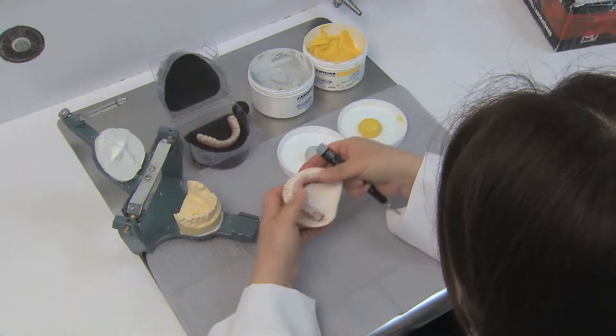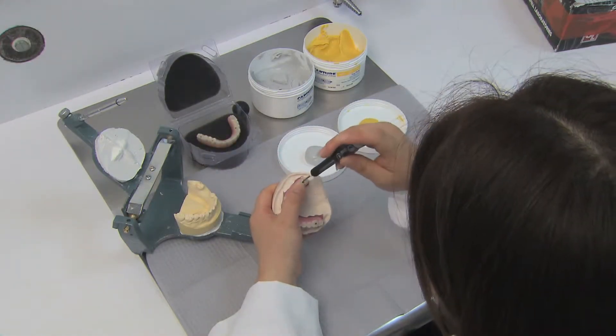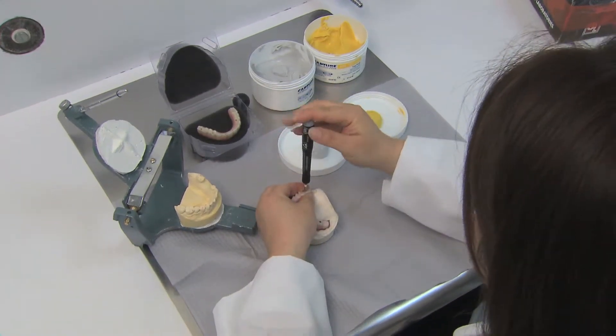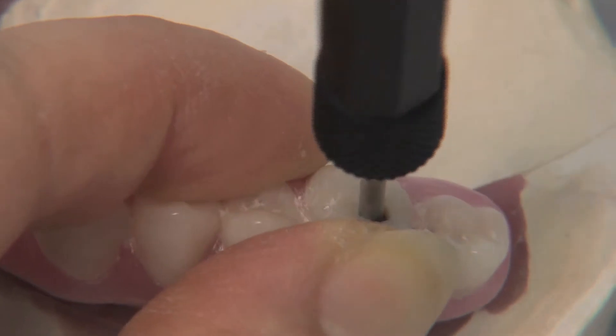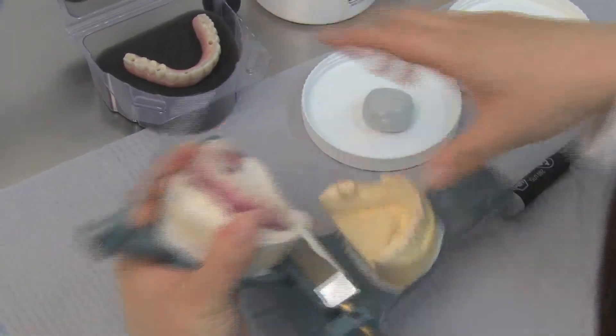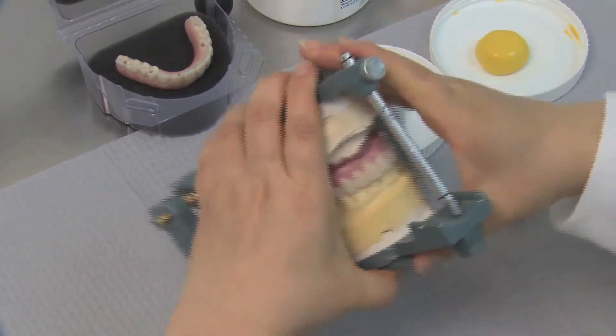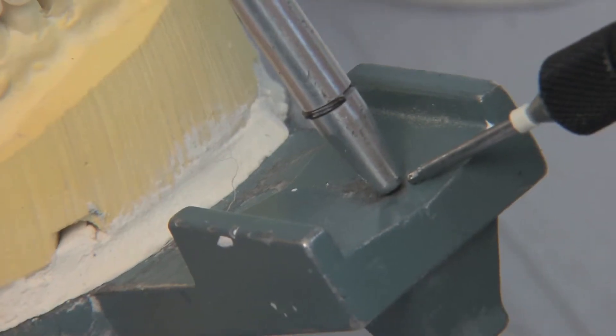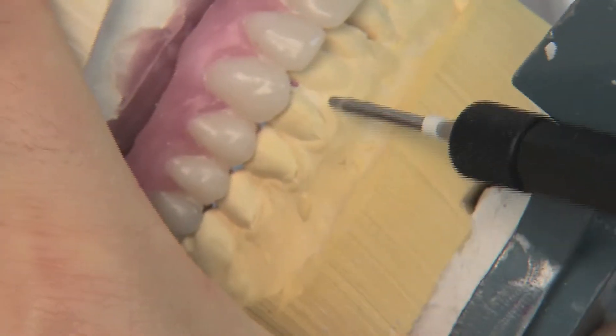The technician begins by attaching the denture setup sent from the dentist onto the stone model base, making sure the screws are properly tightened. The denture setup is then placed onto the articulator along with the opposing model. The bite is checked to make sure the occlusion matches that of the patient's own dentition and is seated correctly.